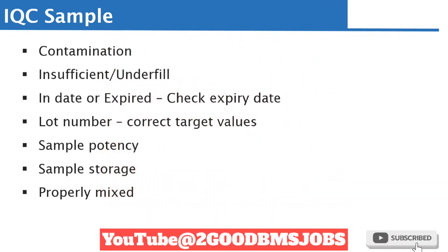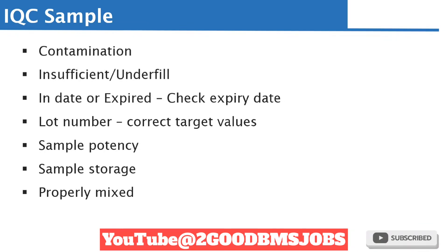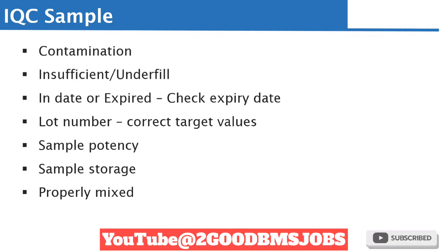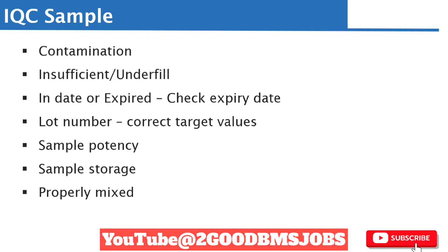We are going to look at each factor individually. When it comes to the internal quality control sample, factors that could lead to failure include contamination — if it is contaminated you may need to get another vial — or insufficient sample volume, in which case you get another control sample. Another thing to check is whether the sample is in date or has expired; if expired, you discard it and get another control sample.